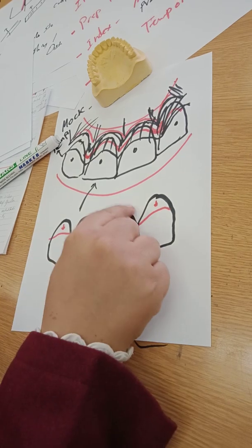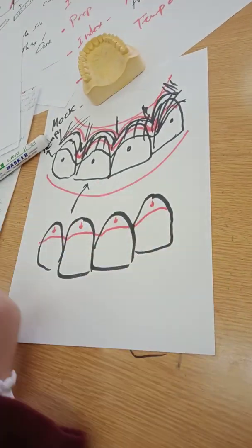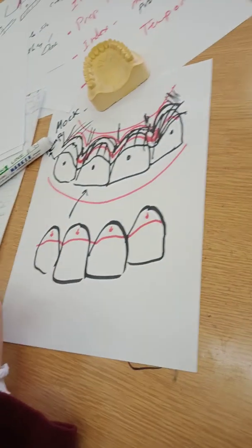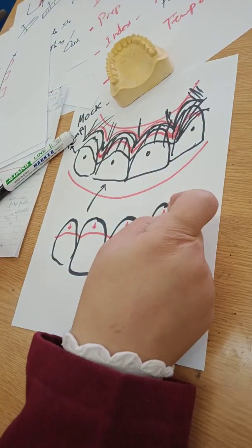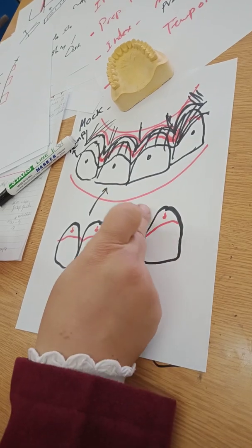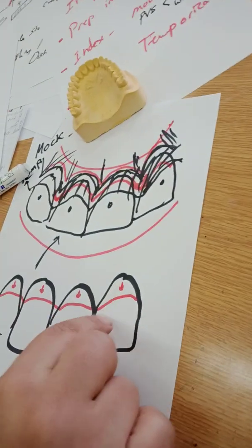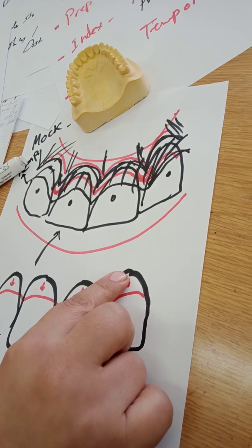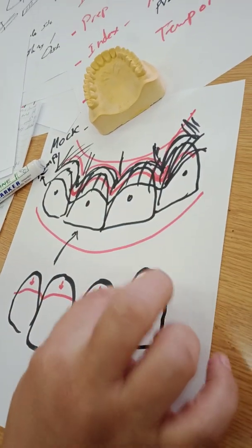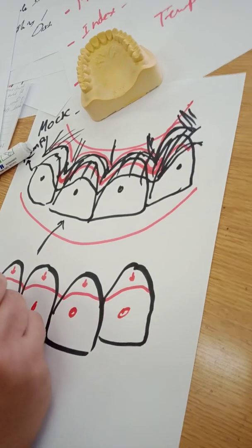What do I fill these areas between the finish line of the veneer and the material that I added with? Flowable composite. So with flowable composite, I flow the composite inside these areas, and with a chisel or plastic instrument or Hollenback applicator, I clean the incisal totally, without etch or bond. Here it will bind because this is resin and this is resin. It will bind together. When you light cure the flowable composite, it will bond with each other. And you have already retained them by the acid etch and bond you placed pinpoint.